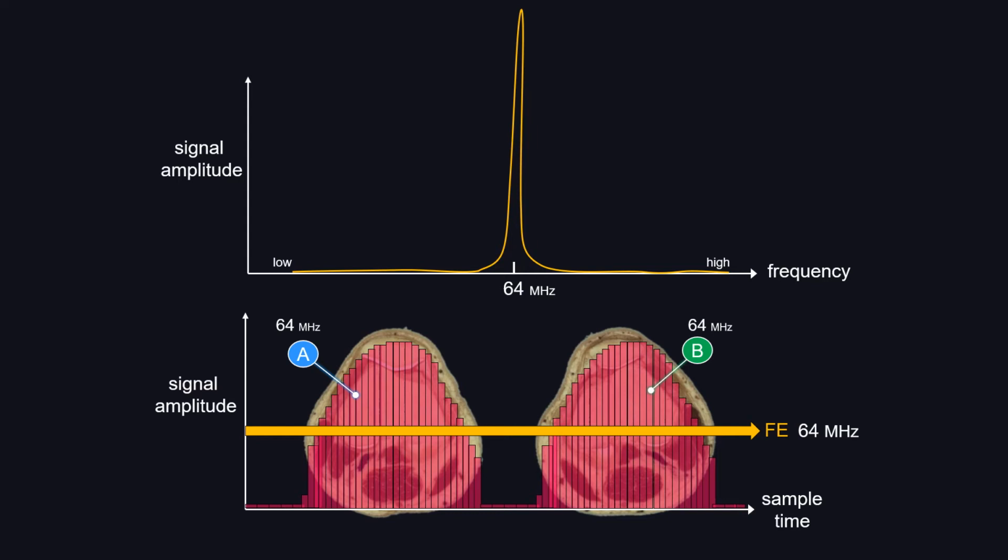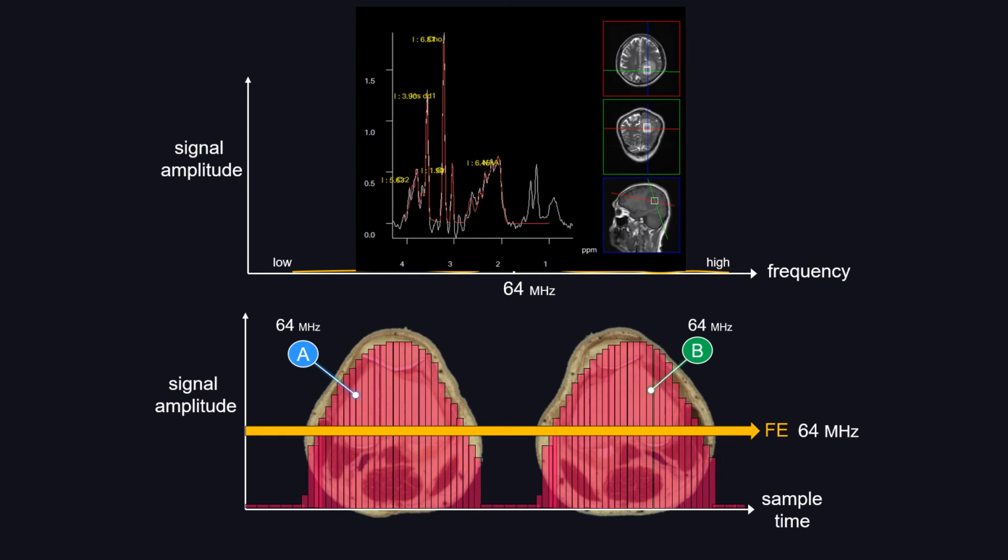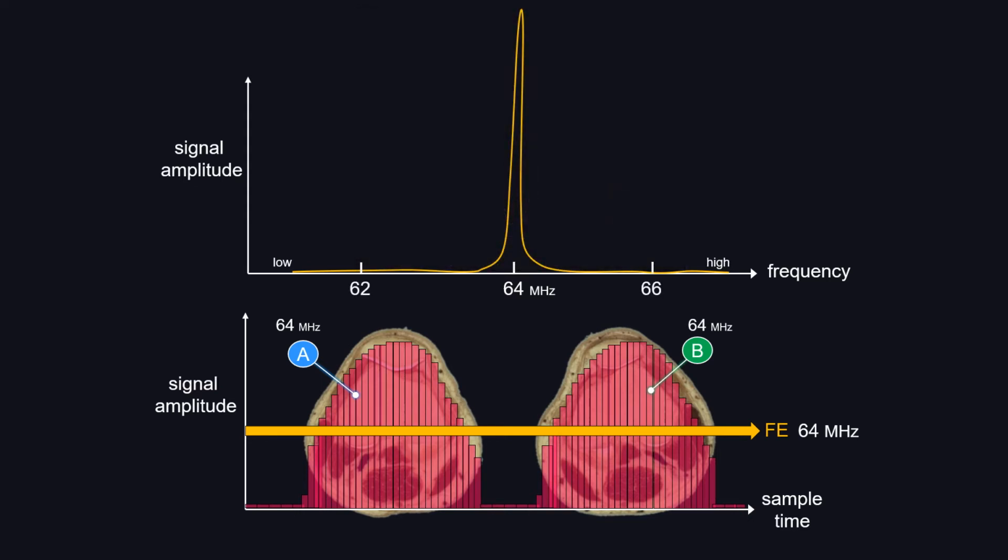This type of graph is only useful in telling you that there's a positive signal. It tells you nothing about its location. Do we even use this in radiology? The answer is actually yes. That's what spectroscopy does. Remember, with spectroscopy, you just put a region of interest. You don't really care where the signal is coming from. It's all coming from the same voxel. But for anatomical imaging, this is essentially useless.